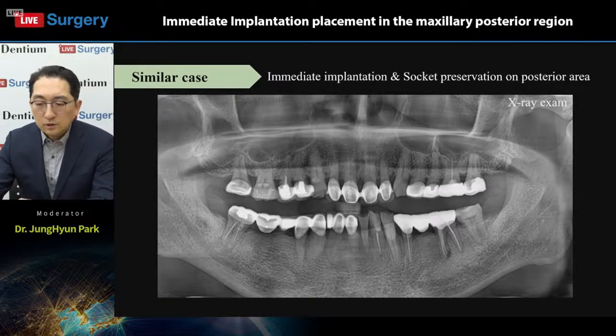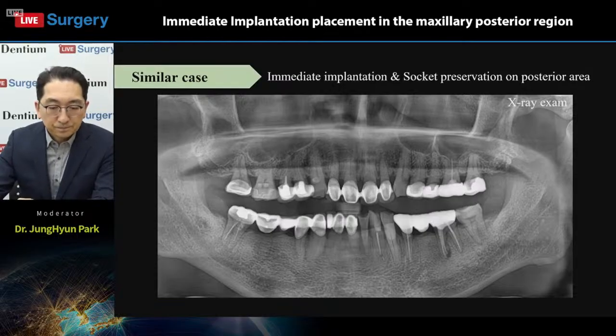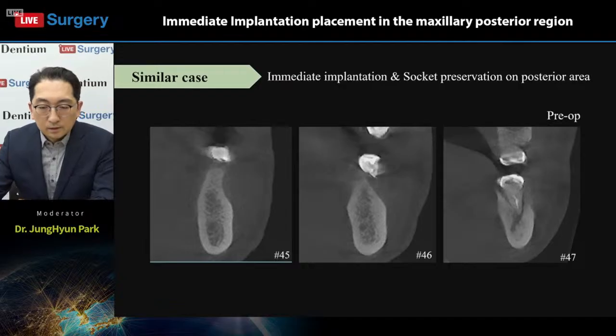Retreatment of the root canal was deemed difficult, so we plan to extract 47 and perform implant surgery at site 45 and 46 because of severe periapical bone loss of 47. You can see that the bone width at 45 and 46 is narrow because of absence of tooth. In this case as well, we decided to use the bright tissue level implant.